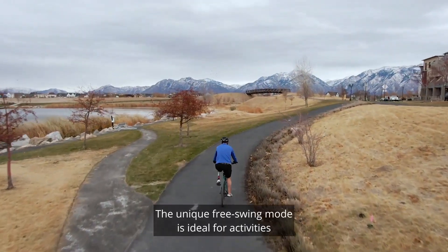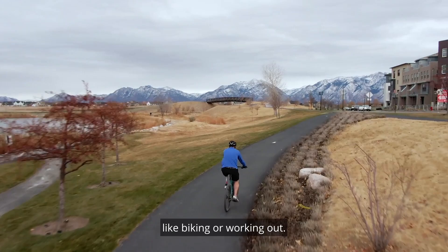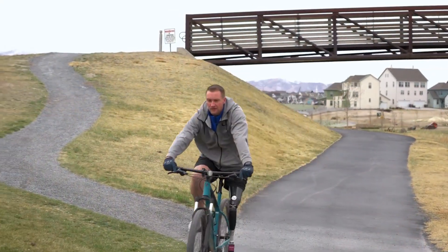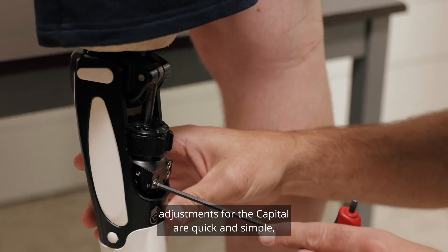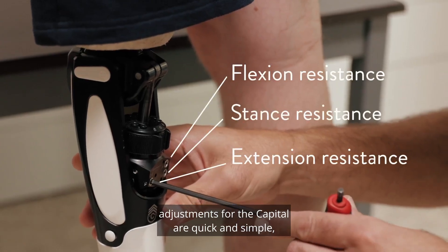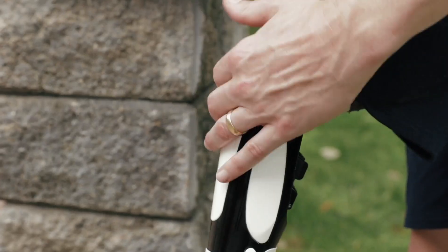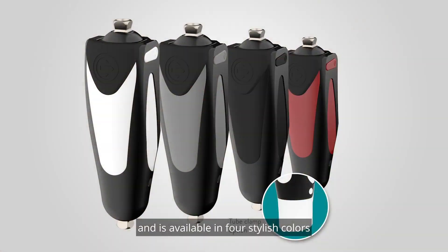The unique free swing mode is ideal for activities like biking or working out. Like the Guardian and Victor Knees, adjustments for the Capital are quick and simple using a 4mm hex wrench. The Capital is also freshwater friendly and is available in four stylish colors with two distal options.